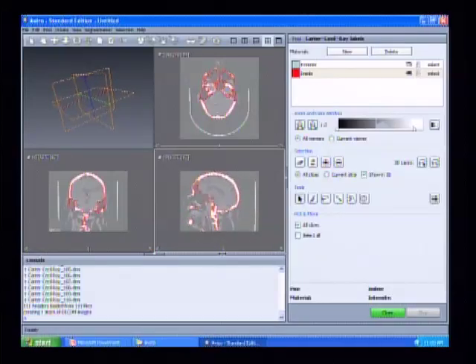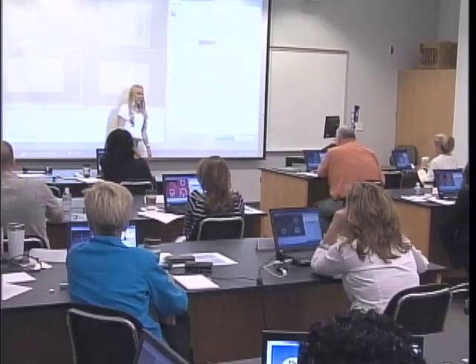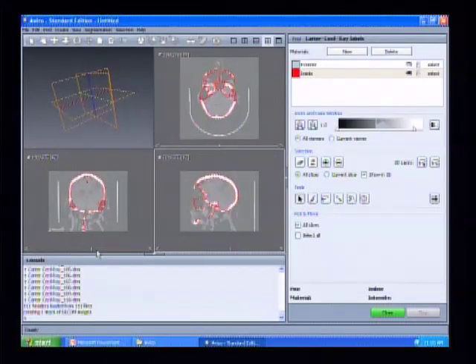In scrolling through, I think it's easy in this view, you'll see this small section that's just in the center here. Obviously, that's not something that we want to have. So you want to scroll through these three views and try to find anything that's out of place.